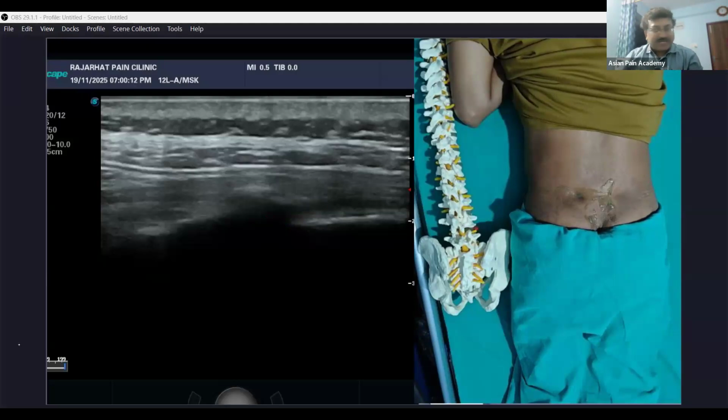So everyone understood? Any questions? Sir, are we going to feel the LOR similar like epidural in this case also? Usually LOR is not done like the cervical or lumbar epidural when we are doing through the space. Usually we inject a dye here, mostly if you are doing under fluoroscopy. If you are under the ultrasound, usually we go for the test dose and aspiration. But LOR that typically we get in the lumbar and cervical area is not done here.